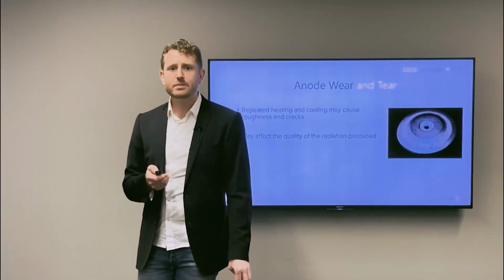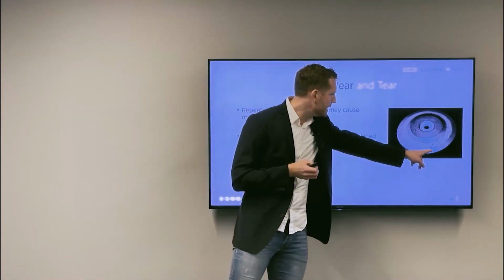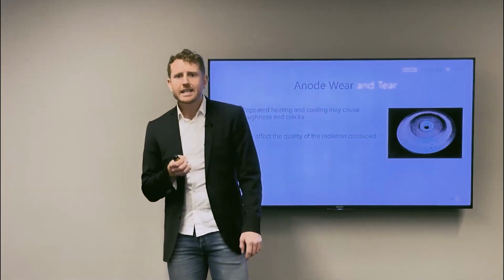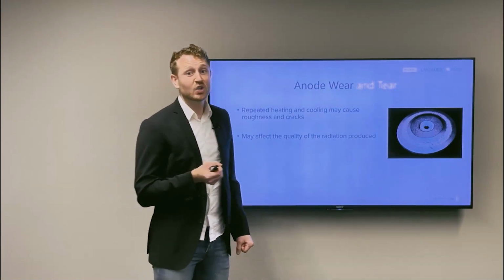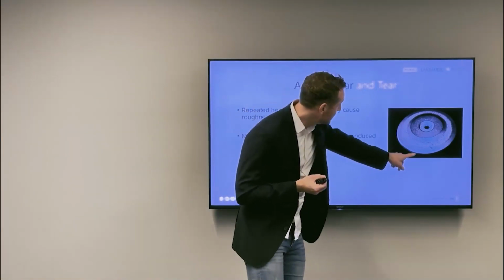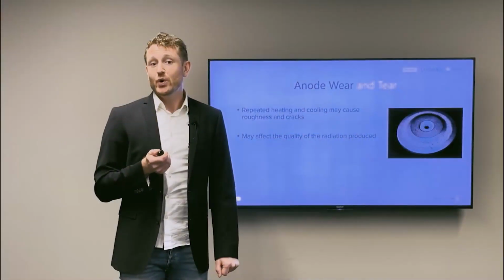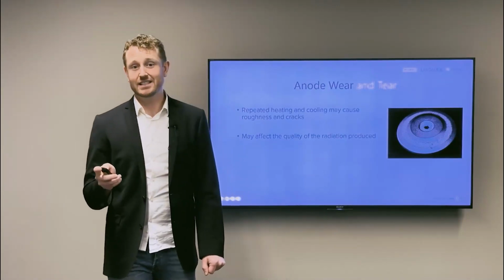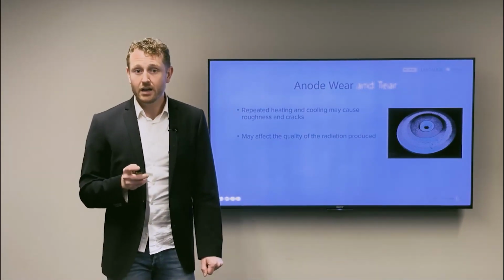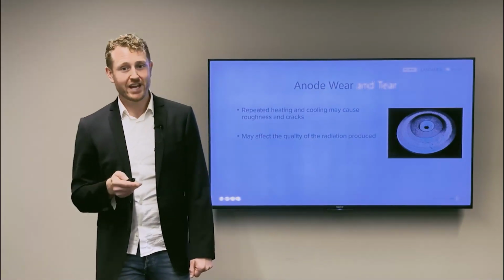It also has been exposed when not rotating, which has resulted in a locally melted tungsten spot. The intense heating of this small area has in addition caused an expansion, which has resulted in a small crack. If the anode then starts to rotate again, this crack may propagate, leading to a complete disc fracture. The roughening of the focal track will cause a drop in the output and change the radiation output spectrum.